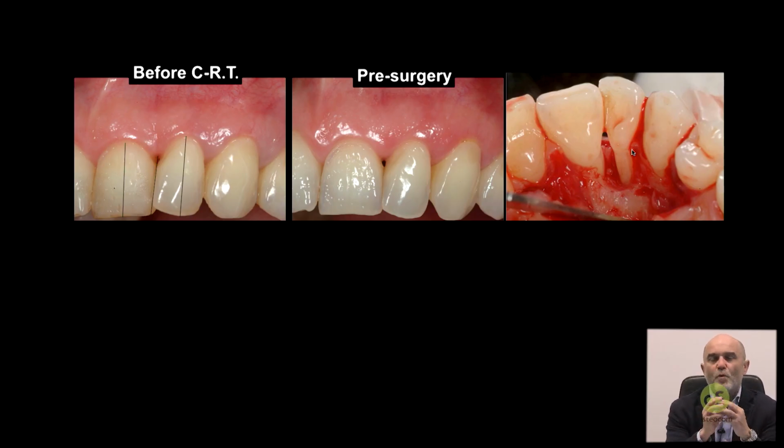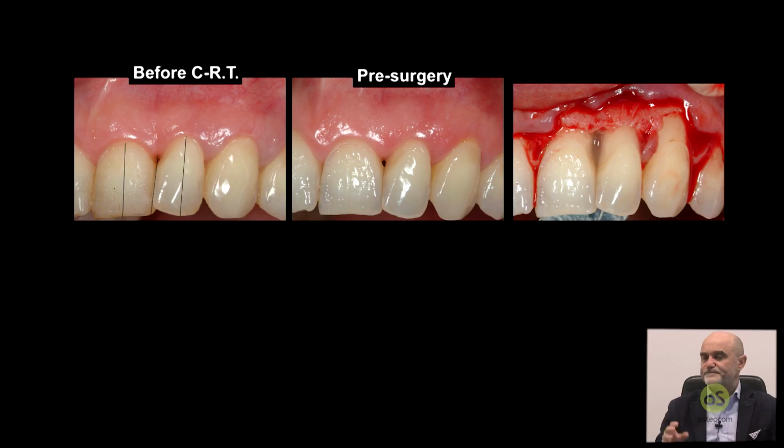And now only one biomaterial is used to promote regeneration, and this is the amelogenins. The amelogenins are used in this procedure, and it's something that I always use in my regenerative procedures, because we have to remember that we don't want to promote only bone. We want to promote bone and periodontal regeneration. And the only material available on the market that is made to promote new connective tissue attachment formation, new cementum formation, and new bone formation is the amelogenins.